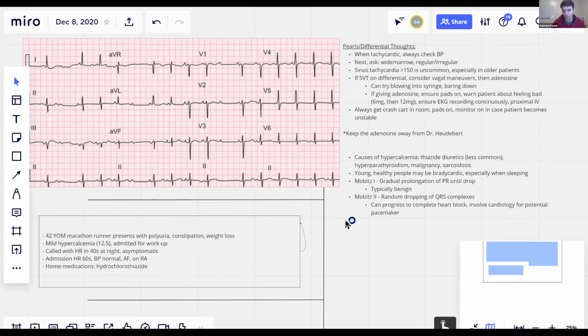Yeah. Okay. So looking at lead 2, the rhythm strip, that's typically the easiest place for me at least to see rhythm changes or rhythm issues. I'm looking to see narrow complex, irregular. I'm looking to see P waves and if they're conducting. So you see P wave conducted, P wave conducted, P wave conducted, P wave dropped. Looking at this sequence, I'm paying specific attention to whether the PR interval is getting progressively longer before the drop. And I don't see that. If I did, I'd feel more comfortable with Mobitz 1, but because I don't, it's enough for me to ask for help and ask for another person to lay eyes on this EKG to make sure they're not in Mobitz 2.